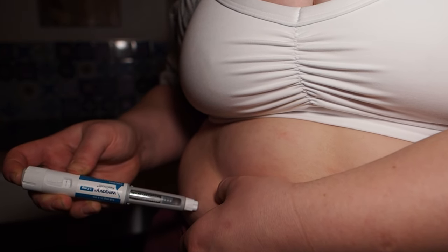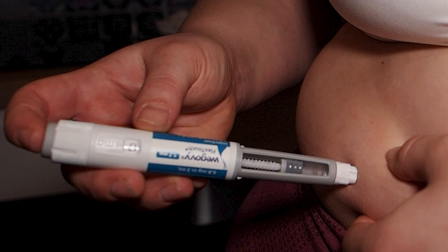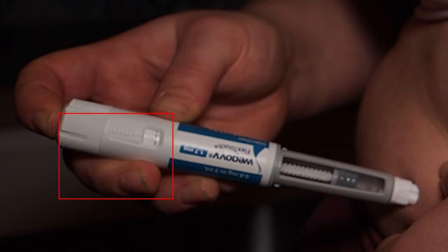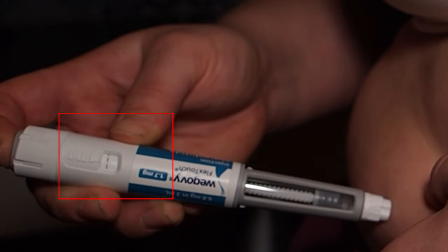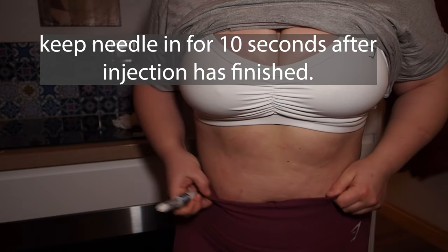You do want to make sure you're holding it in a certain way when you are injecting. Make sure your fingers are not obstructing the little counter mechanism which shows you what dose you're choosing, and that you are facing the counter towards you so that you can see it going down as you inject.